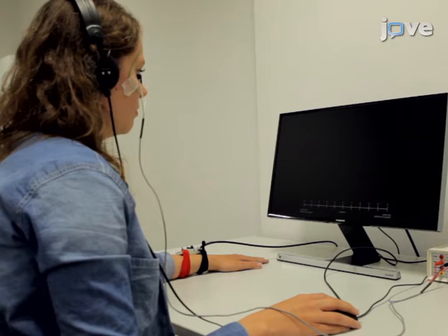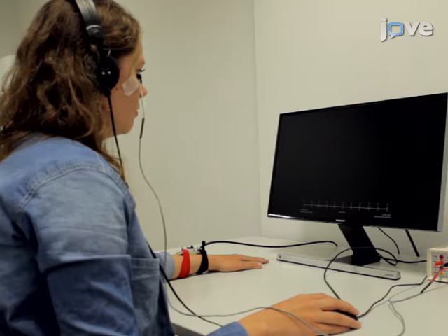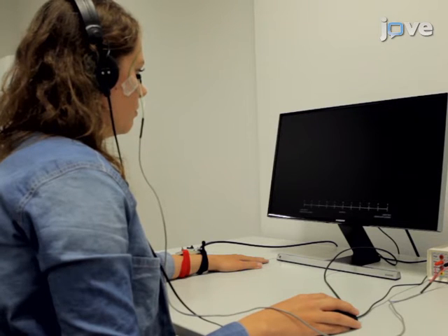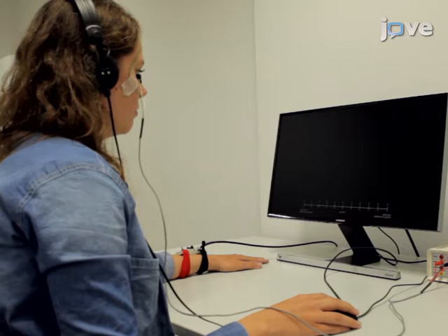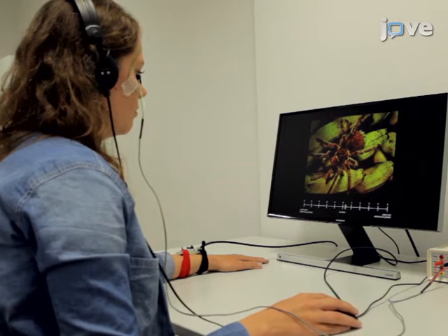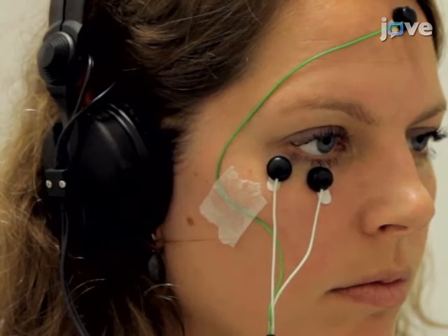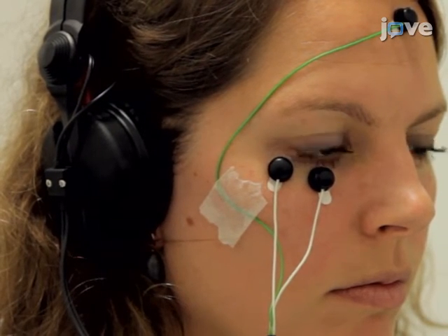Start the experiment from the adjacent room. Begin fear acquisition by presenting 10 baseline startle probes to diminish initial startle reactivity. During fear acquisition, one of the two pictures will co-terminate with the shock on a 75% reinforcement scheme while the other picture will never be followed by the shock. Noise alone trials should be introduced during the inter-trial intervals.